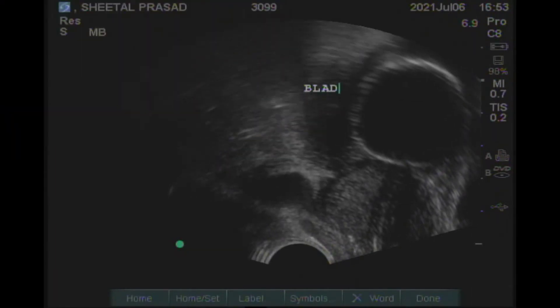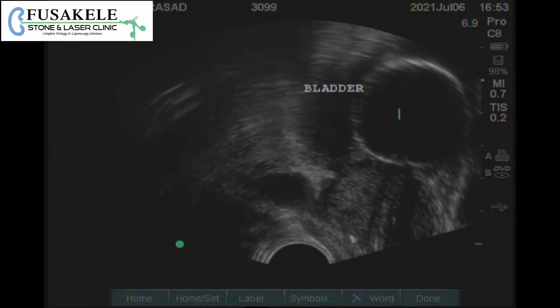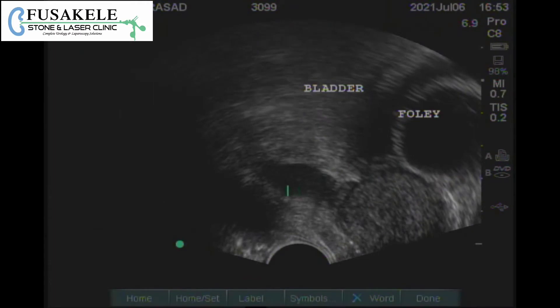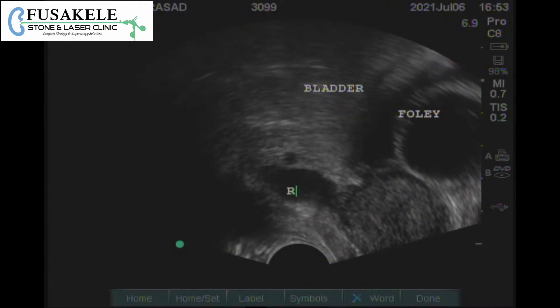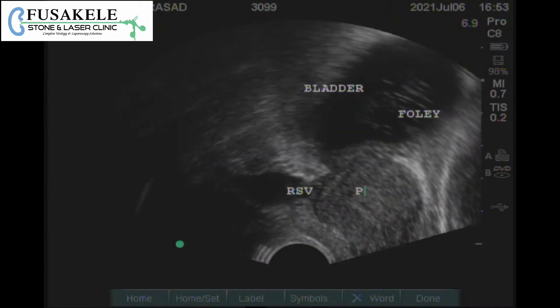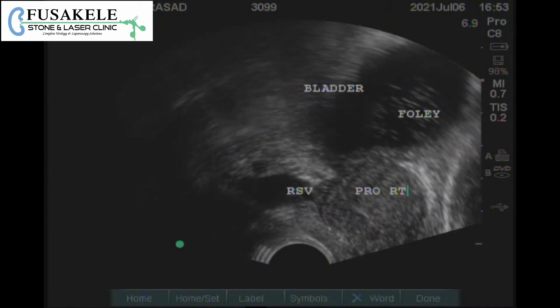The first structure which is identified is the bladder. In this particular case, there is a Foley's catheter balloon visible in the bladder, so this is identified. The right side seminal vesicle is also identified.